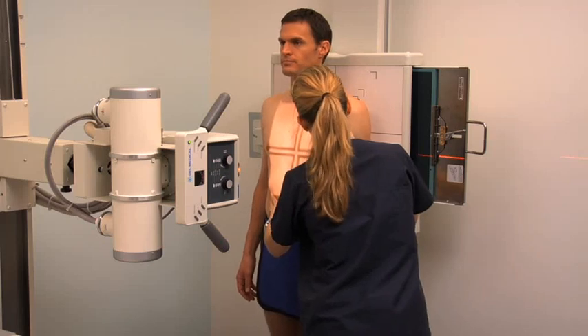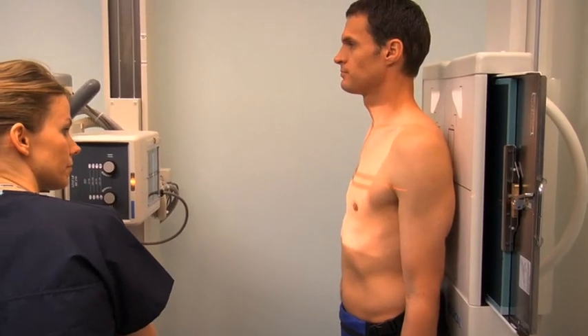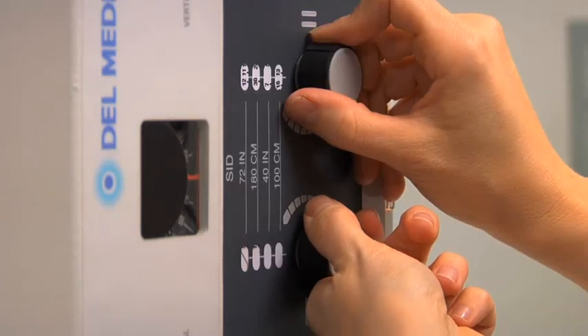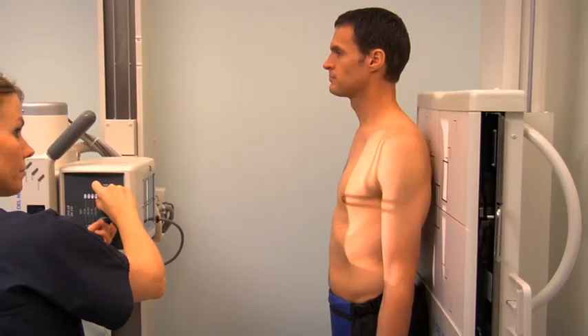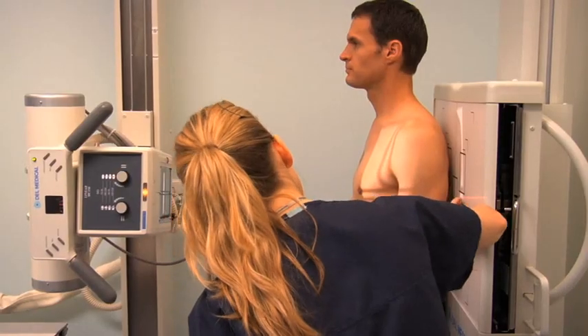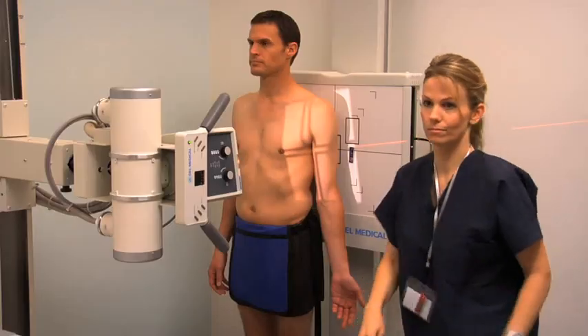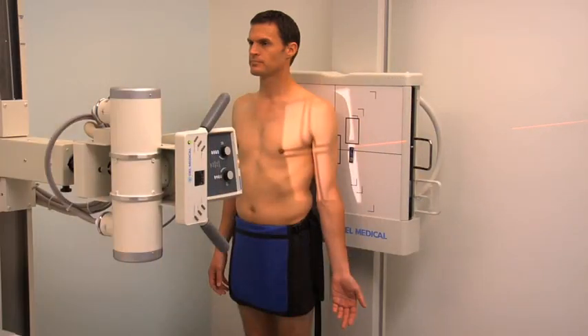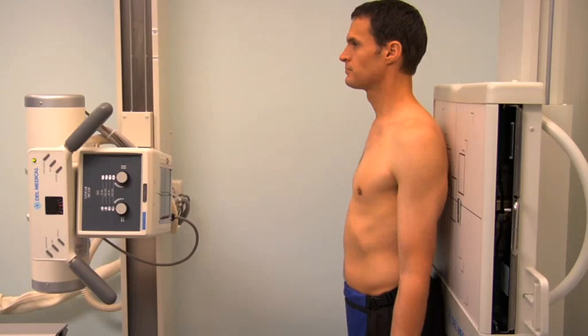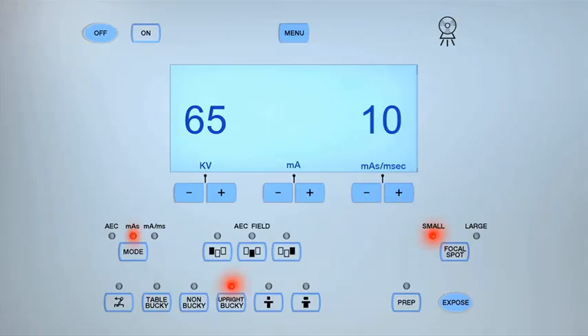Align the humerus with the center of the cassette. Center the central ray to the midshaft of the humerus. Collimate to include the sides of the humerus and both the elbow and shoulder joints of the arm. Place the appropriate lead marker within the collimation field. Stand behind the protective lead barrier and check that the settings are appropriate for the patient's body habitus, making any adjustments if necessary. Instruct the patient to hold their breath and keep still. Expose the cassette by pressing the Prep button and, when ready, press the Exposure button.